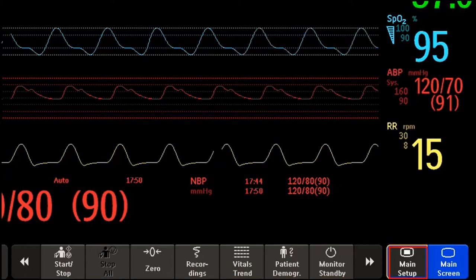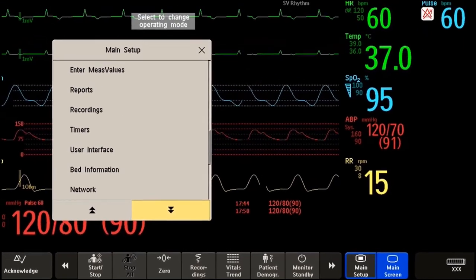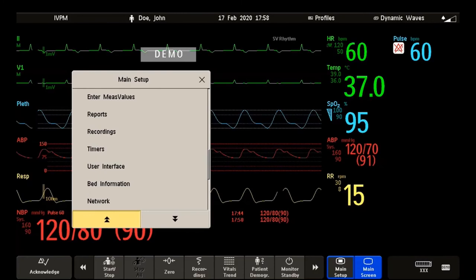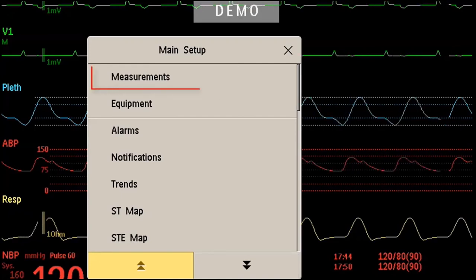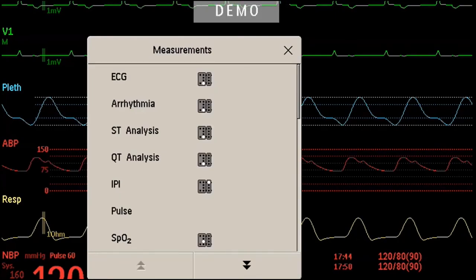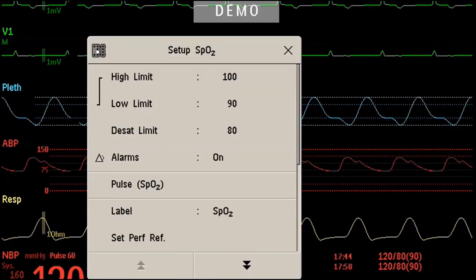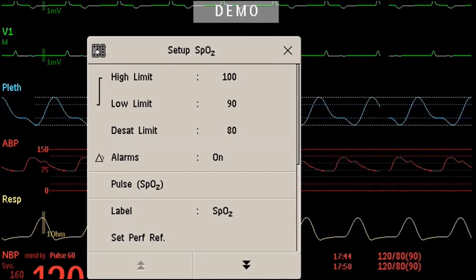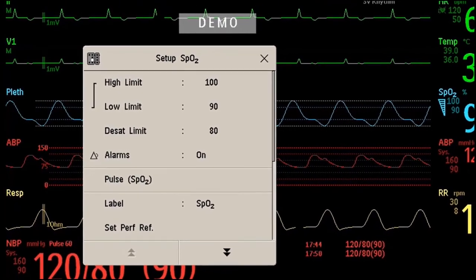The main setup key gives you access to all menus and functions in the monitor. There is quite a lot to scroll and select, but the functions you need most are ordered at the top of the list. Take for example measurements — you probably need this one a lot. Under measurements, you will find all the clinical measurements, for example the SPO2. That is exactly the same menu shown before. You see, there are many ways to access functions, and I'm sure you will figure that out quickly.